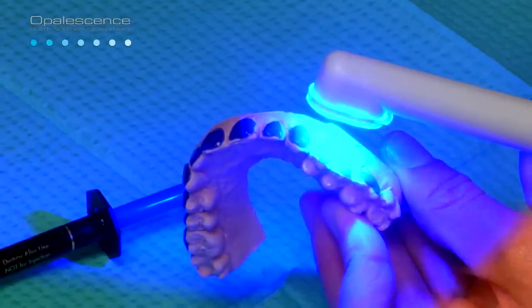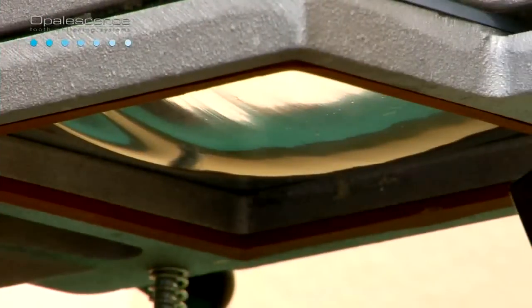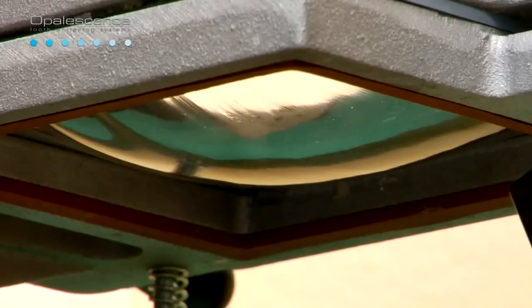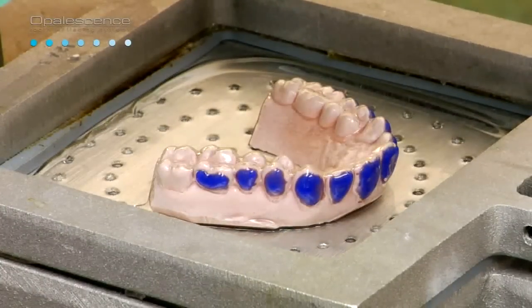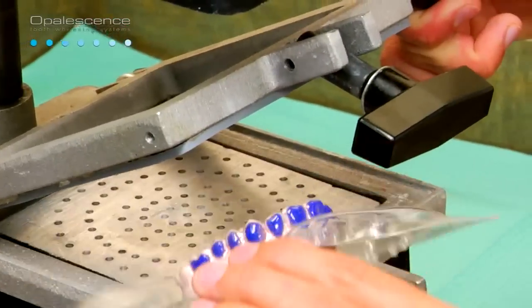Studies have shown that without custom reservoirs, there may be a greater likelihood of physical loss of bleaching agents, which could account for low bleaching potential. Cure LC block out resin for approximately 10 seconds per tooth with a handheld intraoral light. Wipe off the oxygen inhibition layer. With a vacuum former, heat the tray material until it sags approximately 1.5 inches. Activate the vacuum and adapt the softened plastic onto the model. Allow the tray material to cool and remove the model.